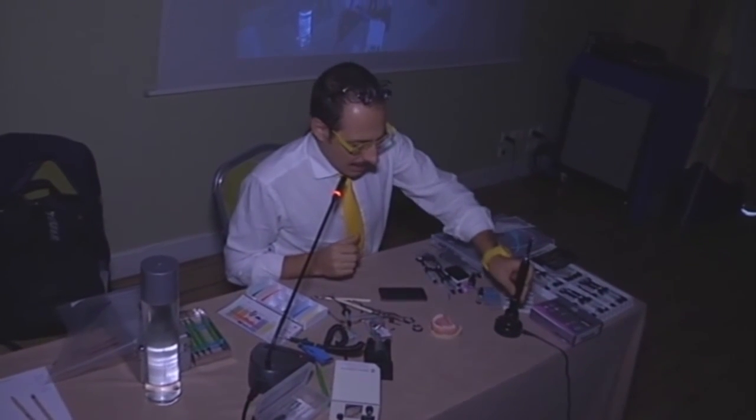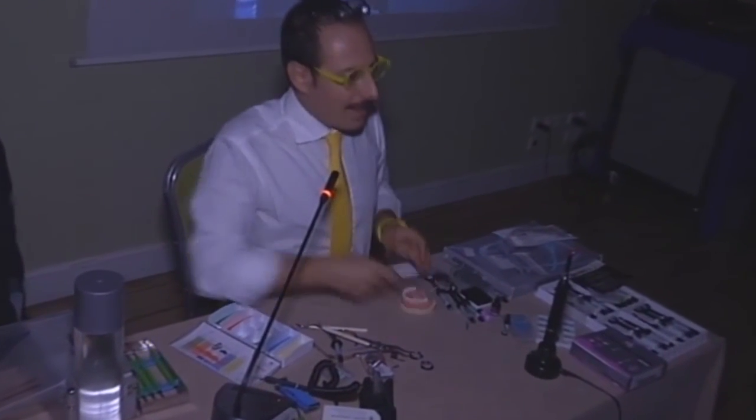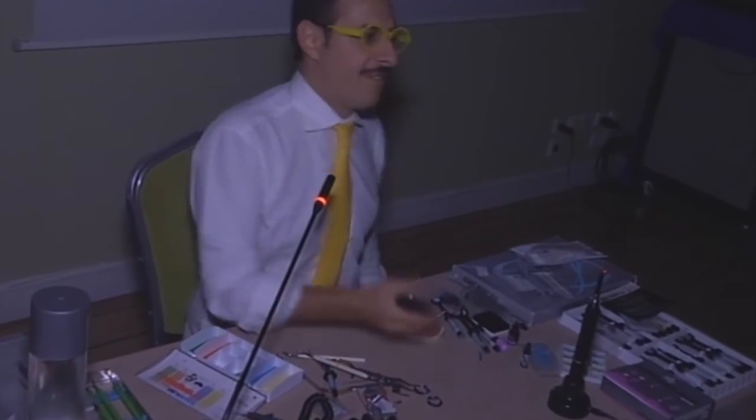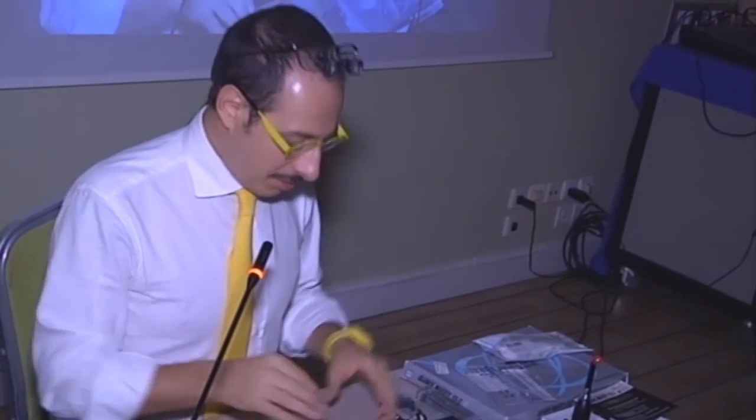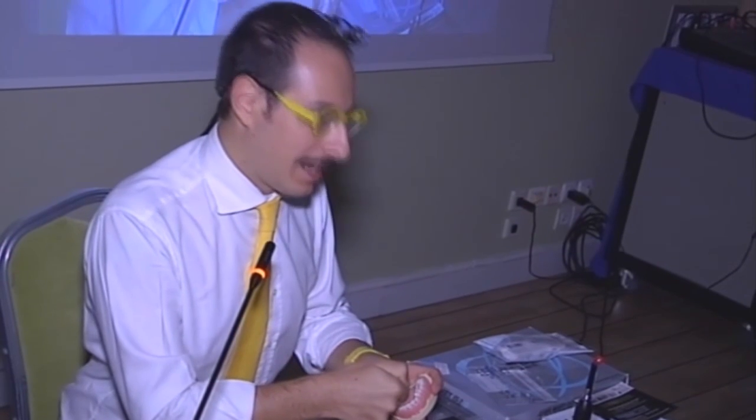Okay. After the last layer, after the polishing? Before the finishing and the polishing procedure, you completed the restoration. You placed eventually the brown, okay, so it's done. You light cure without OxyGuard, so you place the last layer of composite, okay? You light cure the last layer of composite, you check, you do not have to add any more material over there. You place the OxyGuard and you light cure again.